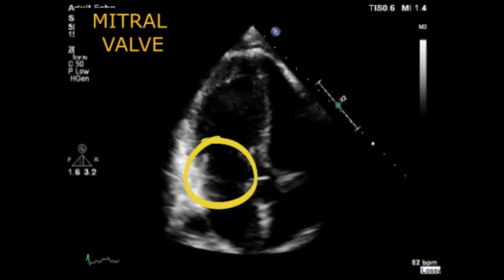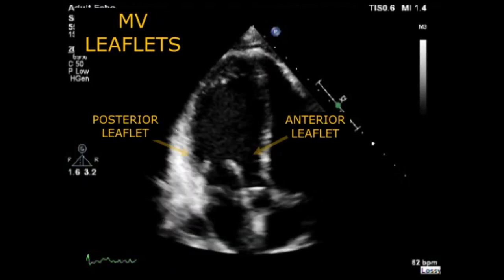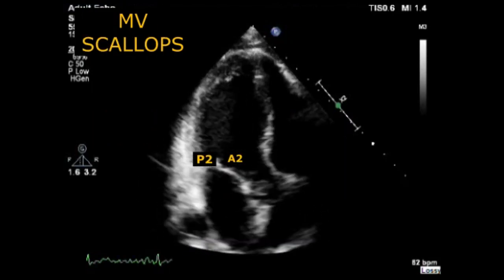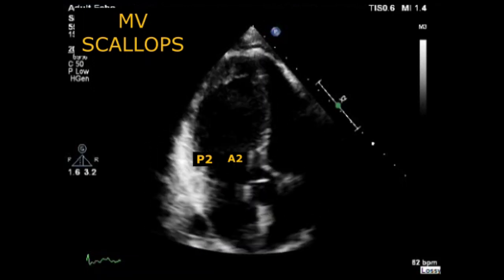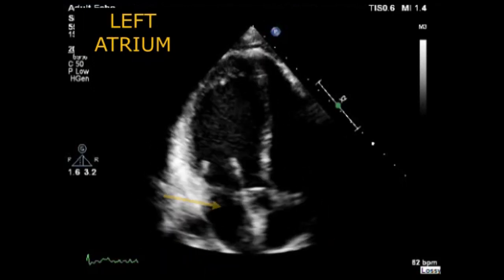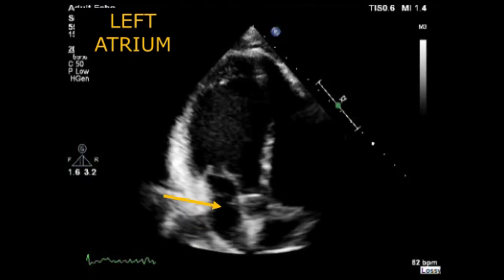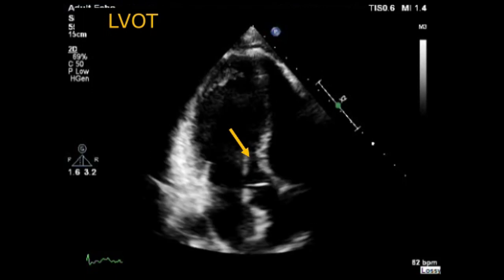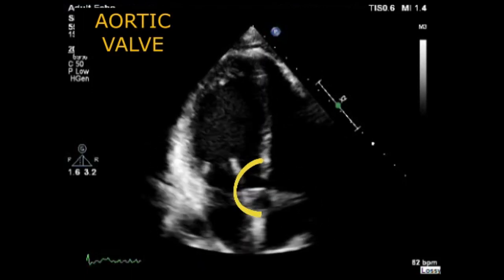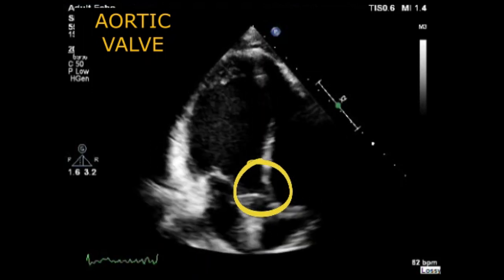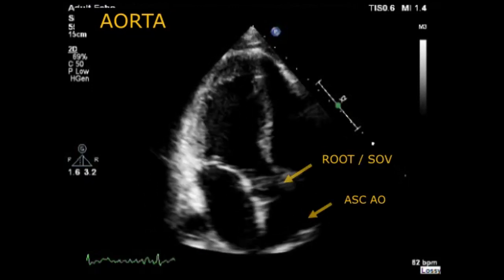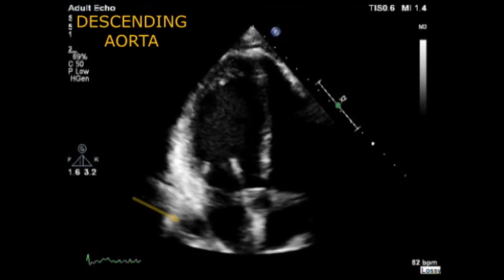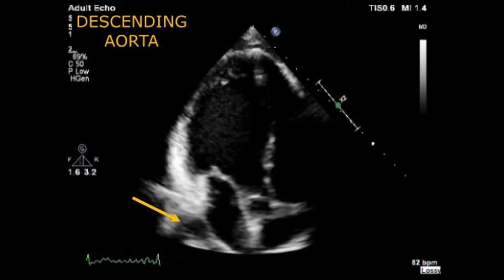The first valve visualized on your left is the mitral valve. In this view we can identify the different mitral valve leaflets and the different mitral valve scallops. Under the mitral valve, the next chamber we can see is the left atrium. Like in the 5 chamber view, we can also see here the left ventricular outflow tract, and on the right hand side of the mitral valve we can see the aortic valve. You can also assess the aortic root and the proximal ascending aorta, and sometimes next to the left atrium you are able to see the descending aorta.